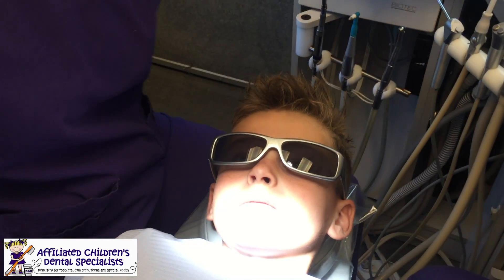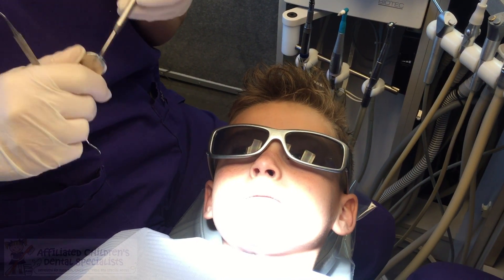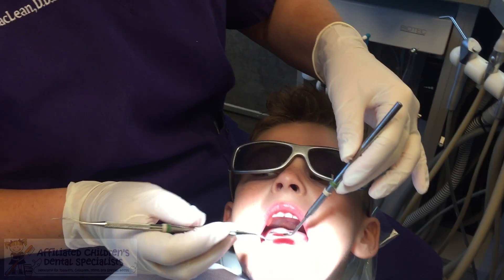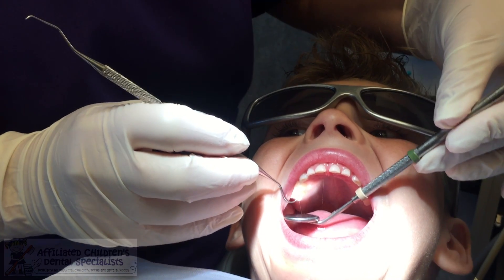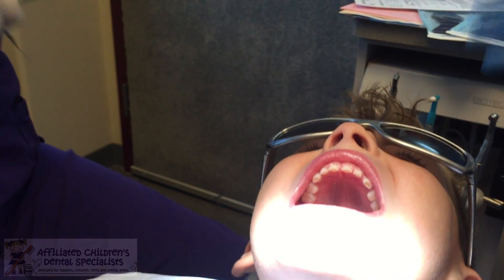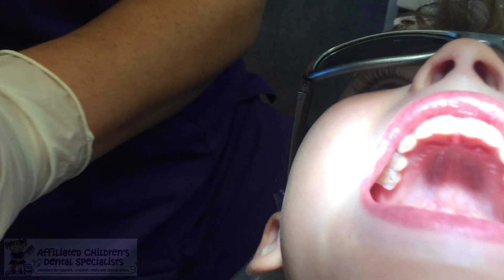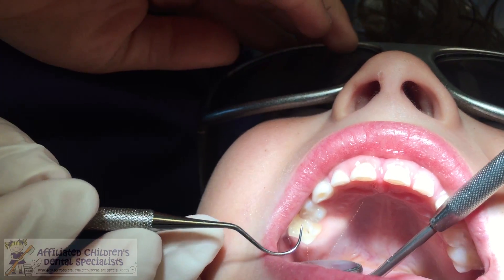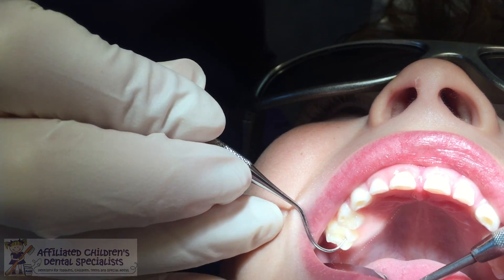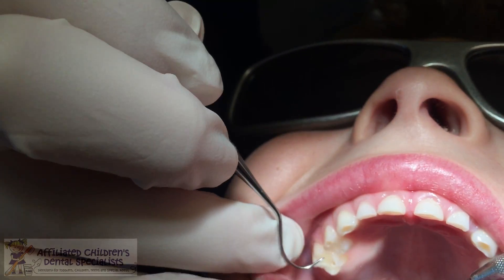All right, Cameron, so you have a little cavity on one of your baby teeth. Can you open really big for me, honey? So way back here. Can you lift your chin a little bit so my friends can see? Can you see that occlusal decay on A? Let me turn it back. So let's get a little picture of that. It's an occlusal on A. Right there. So just that little occlusal cavitation.